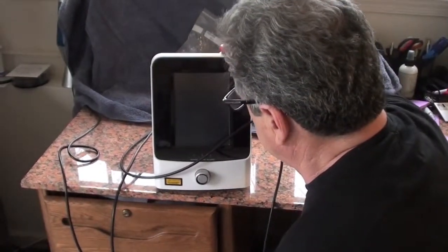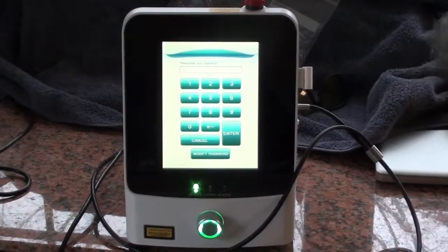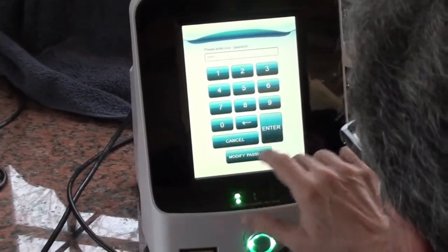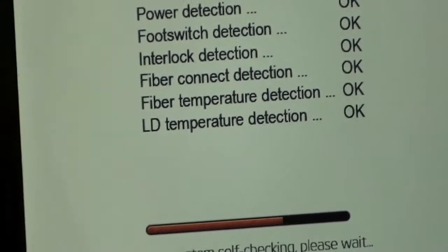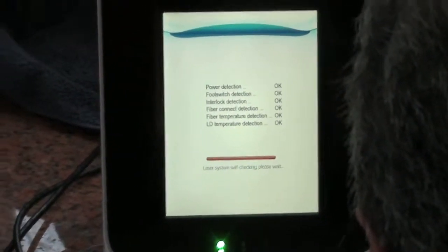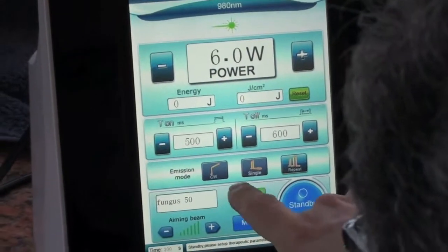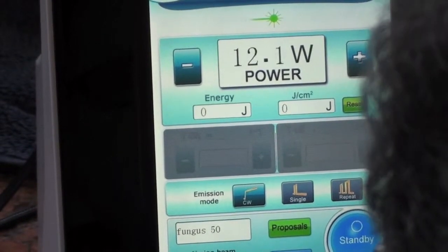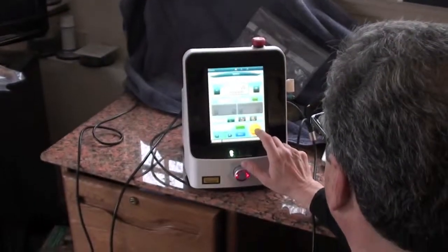Turn it back on. It's 4 zeros. And remember, when you're doing therapy, it's continuous. And we're going to take it up to 15. If it's on the dorsum of the foot, and you'll see the protocols that were given to you, you would make it a little bit less if it becomes warm. So we're at 15. And you press standby. You also want to set it, and it's ready to go.